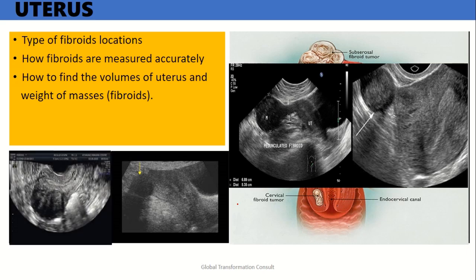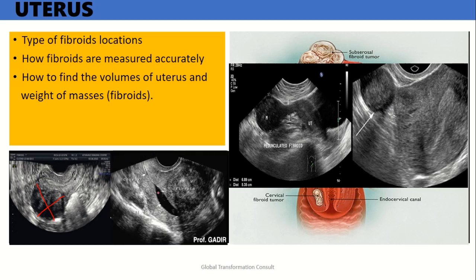And the next further location of fibroid is intramural, partly subserosal. This is intramural and it's measured, so you can see the longest part. You don't do like this, fine. You can also say this. So you can see this is longer to this place. Then the next is also another one. So this is a typical example of intramural fibroid.